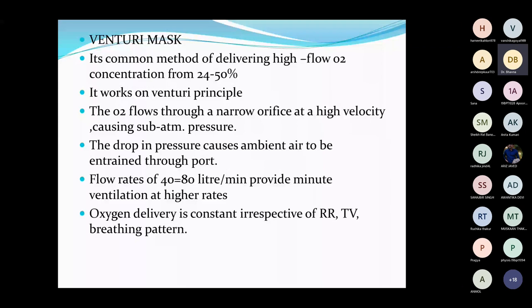Then you come to the Venturi, right? Now there are different types of Venturis available in the ICU depending upon the patient need and requirement, right? So Venturi is the most common delivery method in the high flow system, where the concentration of oxygen is 24 to 50%, which is quite appropriate while putting the patient on oxygen therapy.